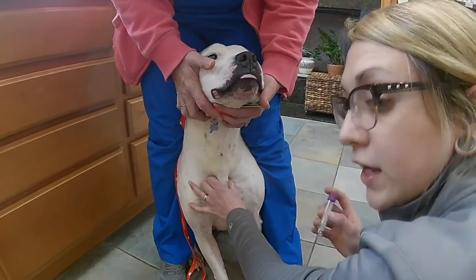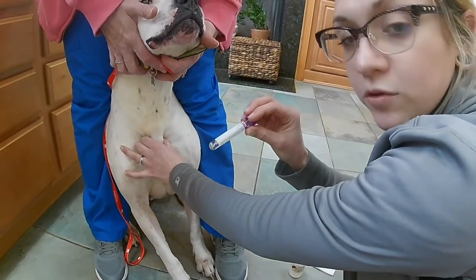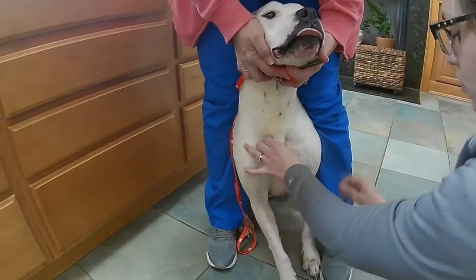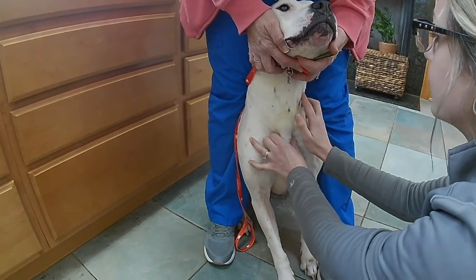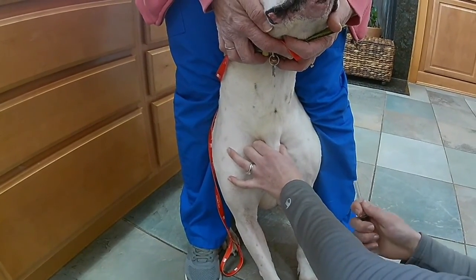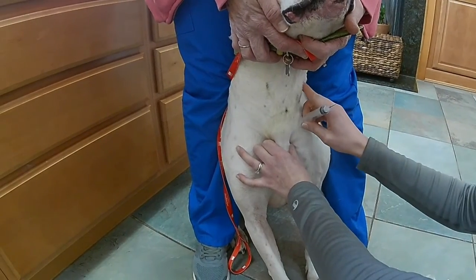So I'm drawing in a lavender top EDTA tube. Since I will be doing a CBC, I need anticoagulated whole blood. So here we go. I'm going to get familiar again. I'm using a 20 gauge needle with a 6 ml syringe to get my sample.